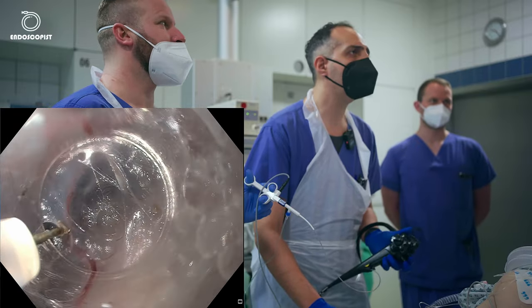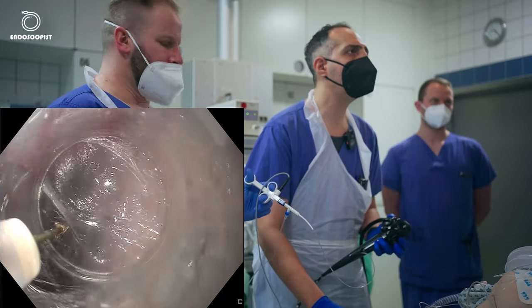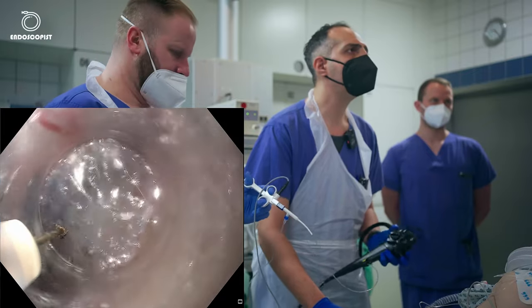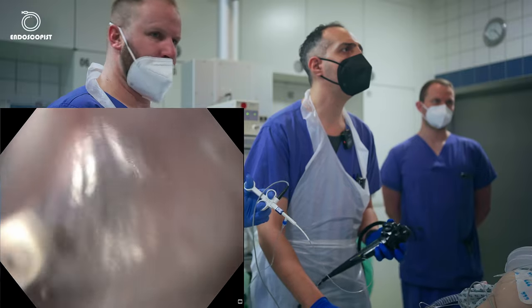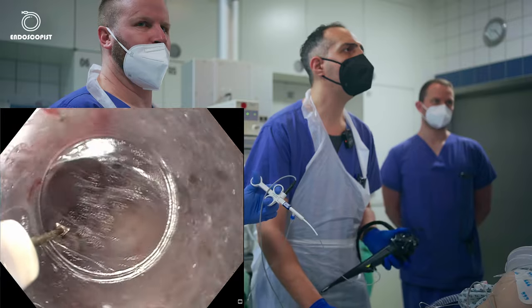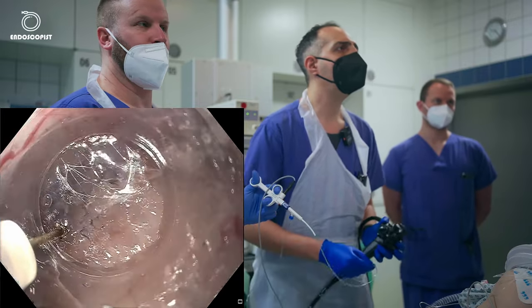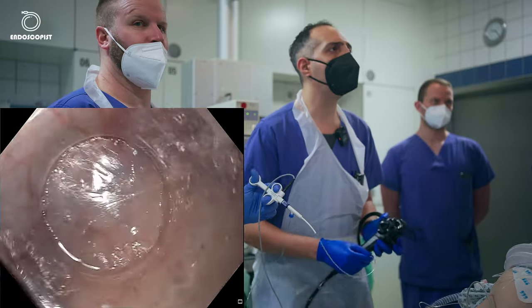Here is a vessel, so that's what's nice with this knife. You can coagulate the vessel. Cautiously, of course. And I always use the physical traction or tension I can apply with the cap.